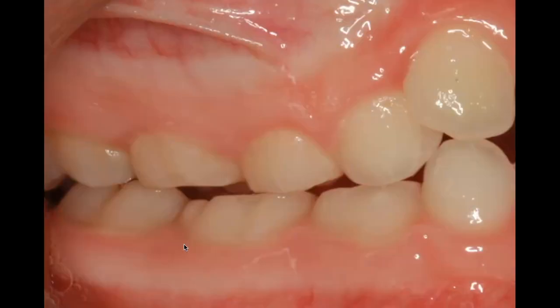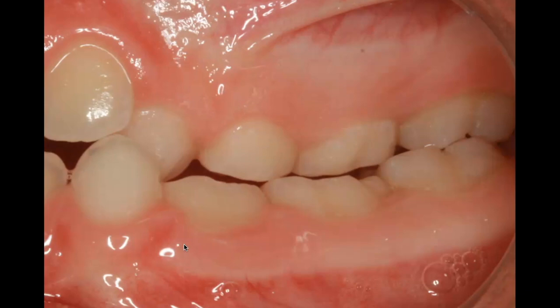Okay? So here's our left side occlusion. You can see that we're not in a crossbite, although we do have a tendency on that right side. Okay? So not a full lingual crossbite. I think if it was a full lingual crossbite, you would have seen that left side even more upright than you do, but definitely more of a crossbite on the left side all the way up to the level of the canine. Now, hopefully we have a shift, right? Because if we have a shift, then we expand. Where does the midline go? Yeah, back to the middle.